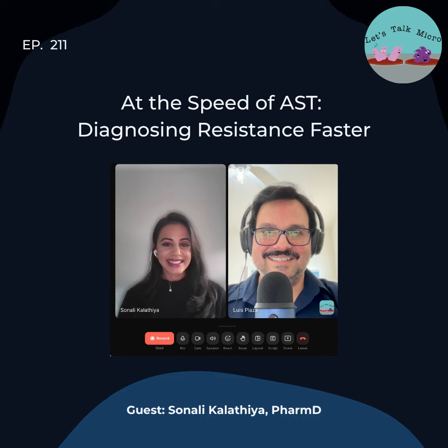This is such an important question because it's so important that we do this multidisciplinary work to really promote the success of bringing something like this on. And there's benefit in collaborating as early as the initial phases, when you're even just deciding whether or not a test like this, a FAST AST, would be impactful for your specific institution and your specific patient population.